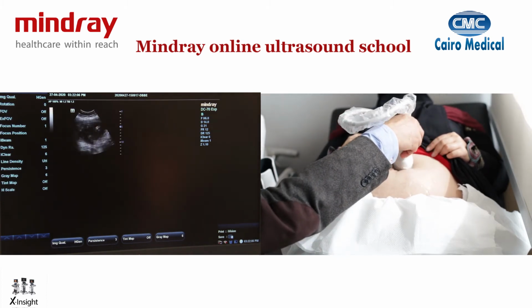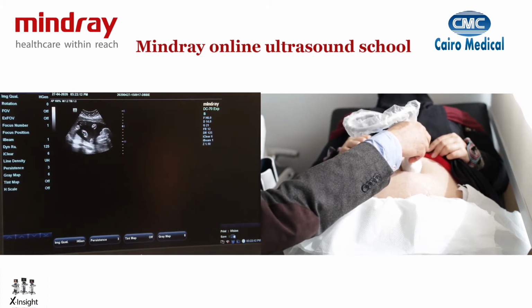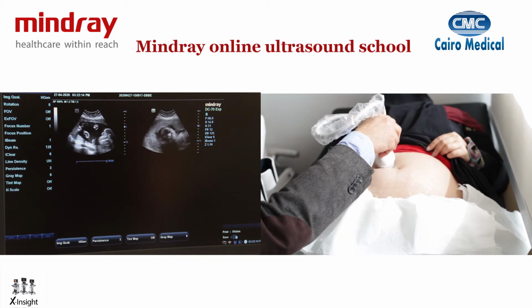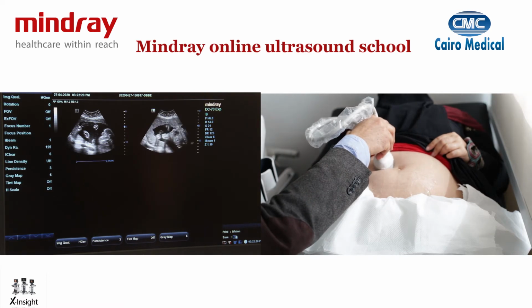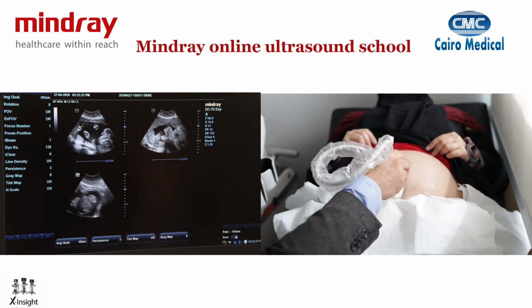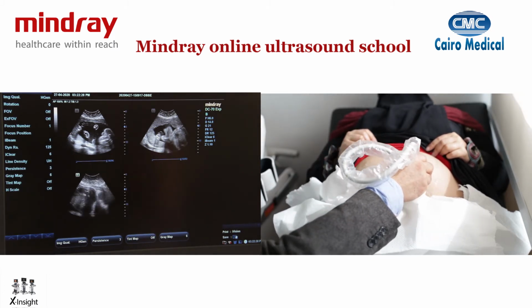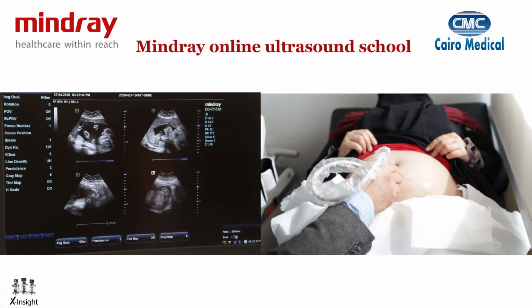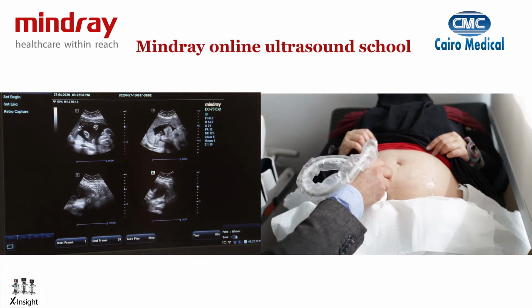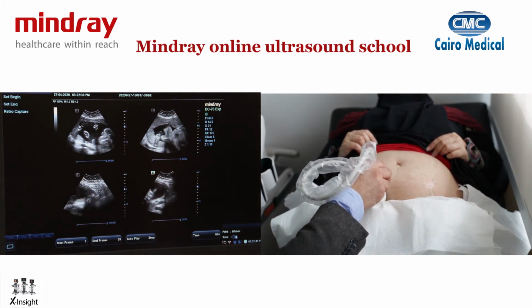One on the top left side, so I move from the midline, still the probe touching the abdomen at a 90 degrees angle, and I find the deepest vertical pool of amniotic fluid. Again, I'll do it on the right hand side and find the deepest vertical pool of amniotic fluid to measure. And then I'm going to go below the umbilicus and move to the bottom pocket. So I'm going to move to the left lower pocket where I can measure the amniotic fluid. Obviously, I'll try to avoid where the cord is and the limbs, and again on the right hand side. And then I have 4 decent pockets of amniotic fluid to measure if I want to be doing that.